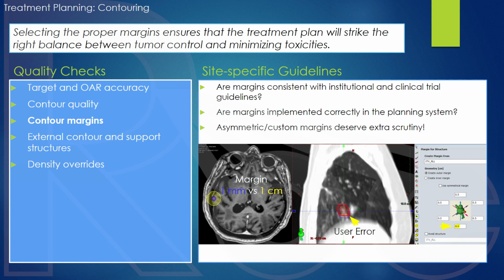Shown right is an ITV, and with this ITV for the lung, what's commonly done is from this ITV, which is shown in orange, that accounts for the motion envelope, the motion during the 4D scan of that gross disease. Typically, a 5 millimeter margin is added to create a PTV shown in red. And in this case, the person creating that expansion had a bad day. They did 5 millimeters everywhere but in the inferior direction. And then all of a sudden, we've missed, or we're too tight on that inferior border. It's so important to evaluate the margins.